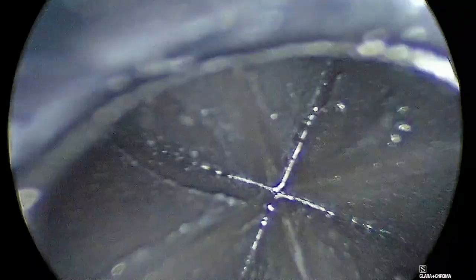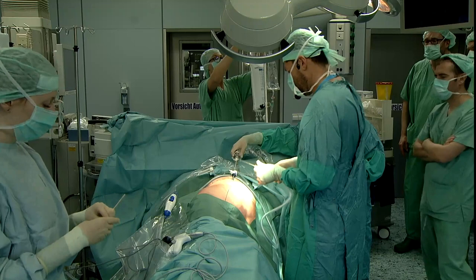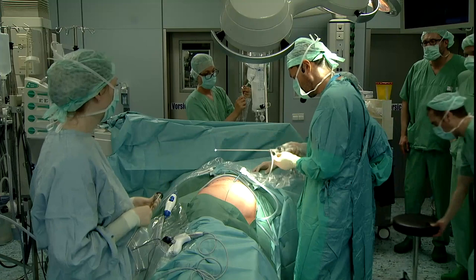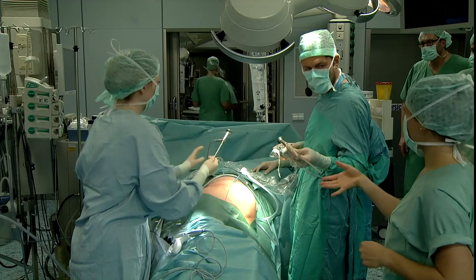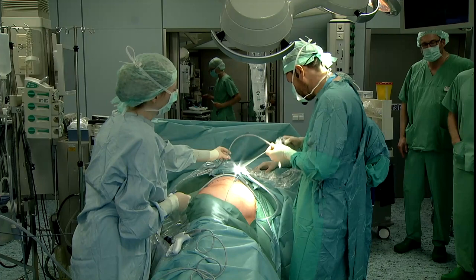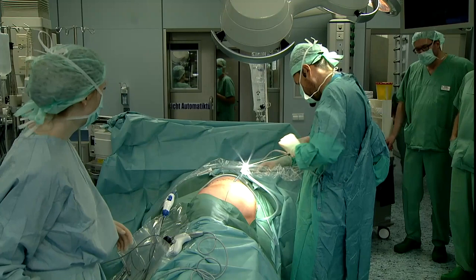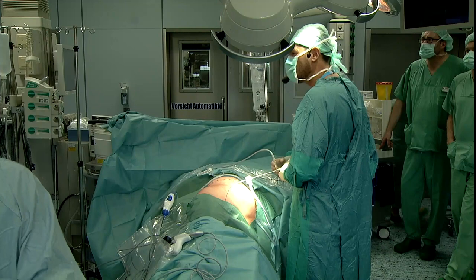So now we switch directly to a 30 degree lens. Always check for the Veress needle. You see the Veress is here, so we didn't do any damage to the bowel. But we always check for it, and then we connect our trocar. The fact that we are with the camera at the very top obliges us to use a 30 degree, and that's what I like very much in any kind of kidney surgery. The trocar position that I'm using is the same for nephrectomy, partial nephrectomy, nephroureterectomy, donor nephrectomy, pyeloplasty, and so on. So basically all the retroperitoneal surgery is performed in this fashion.